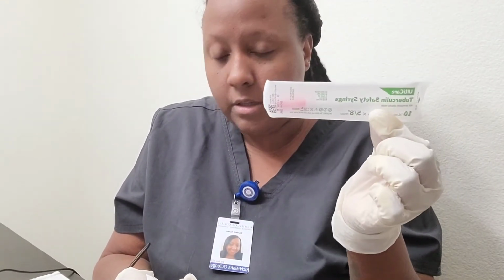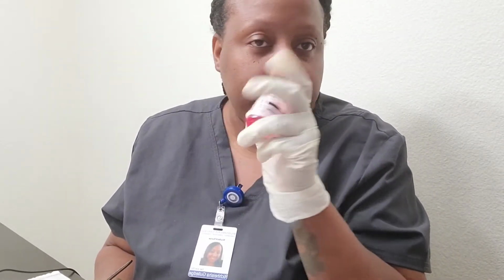Since I did just do my video of drawing up insulin, I'm just going to go ahead now and use this syringe for my heparin, and I'm going to use this since it is a 1 milliliter syringe.